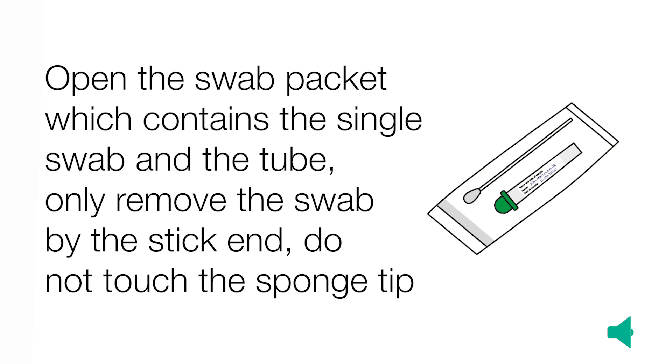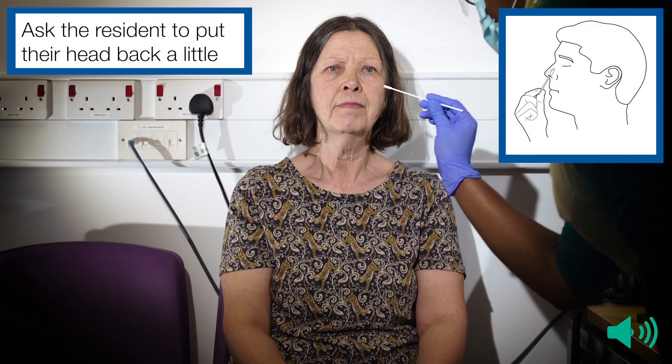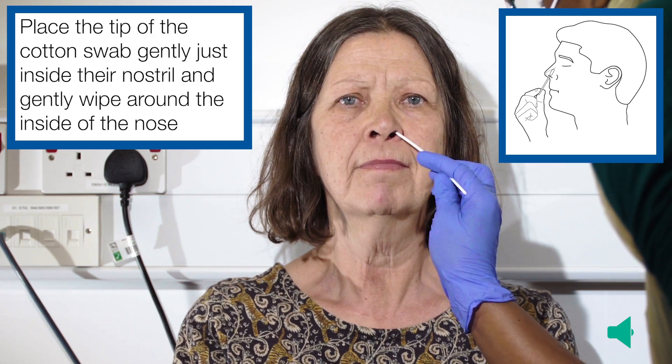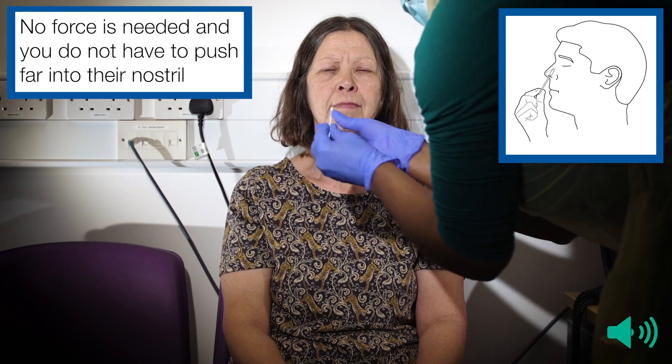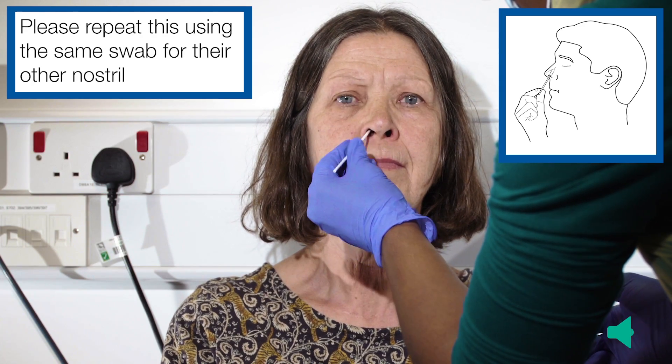Only remove the swab by the stick end — do not touch the sponge tip. Write the resident's name and the date of the sample on the outside label of the smaller tube. Ask the resident to tilt their head back a little. Place the tip of the cotton swab gently just inside their nostril and gently wipe around the inside of the nose. No force is needed and you do not have to push far into their nostril. Please repeat this using the same swab for their other nostril.